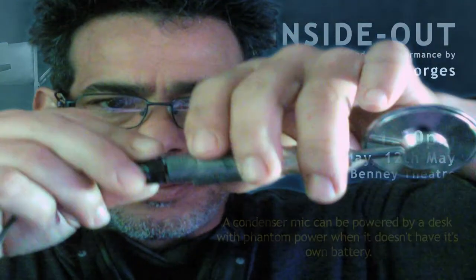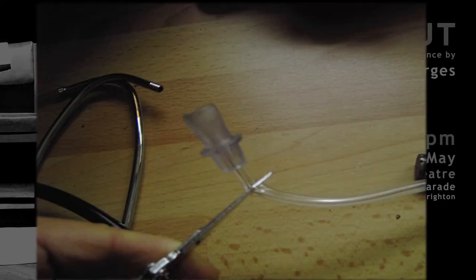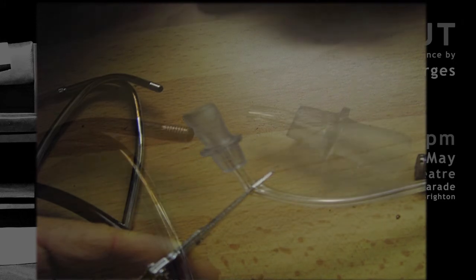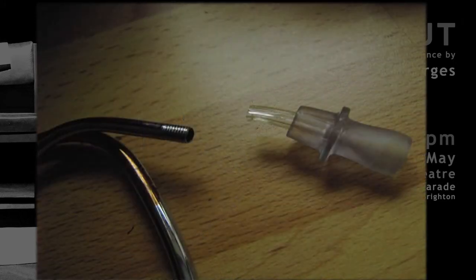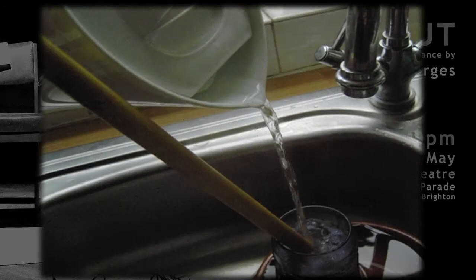Here you can see some images from the process. You can see I got the silicone pipe from an oxygen mask, and in the background on the table you can see the condenser mic and the battery. I was trying to enlarge the pipe so it could fit the mic.